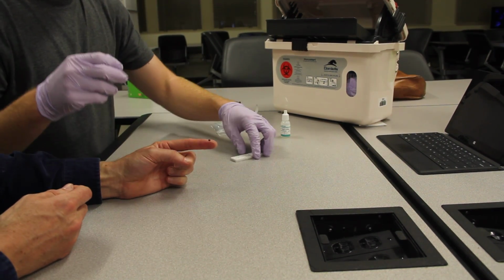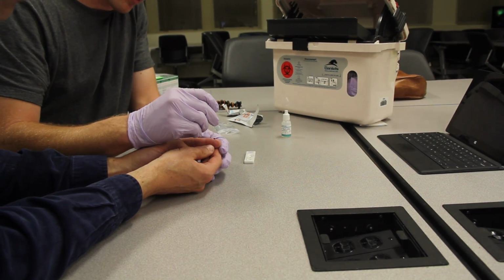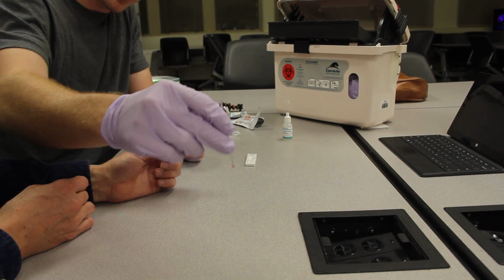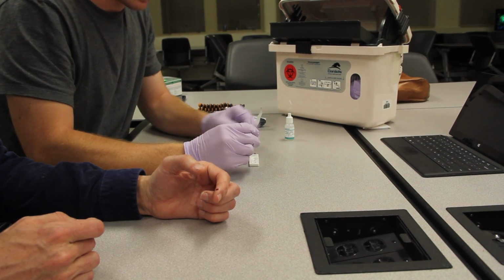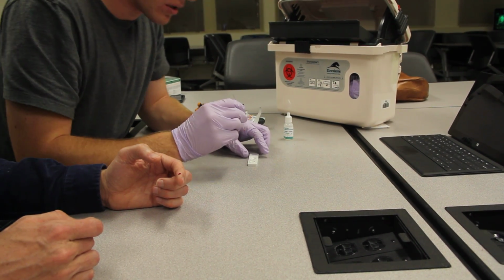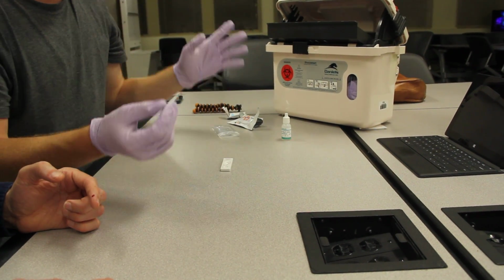Now, next step is I'm going to hold the middle of the pipette or the blood transfer device. I'm just going to touch it to the surface of the blood drop to make sure that I get a thin film across the surface of the pipette. As you can see, I've got that. And I'm just going to touch it very lightly to the section of the cassette that's labeled sample. And if you look here, you can see that I've got my blood sample there. So that should work.